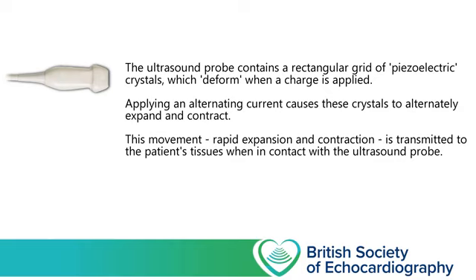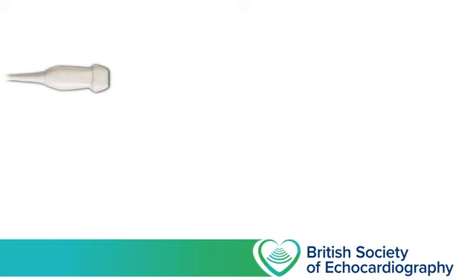So we can apply an alternating current, we can make the crystal get bigger and smaller, we can make it oscillate, and if the probe is held against our patient, then when we generate that kinetic energy, that energy will propagate through the patient in the form of a wave. Let's get a sense of how that's going to work in practice.